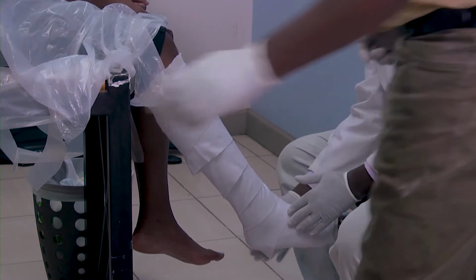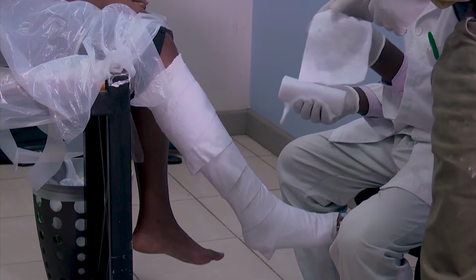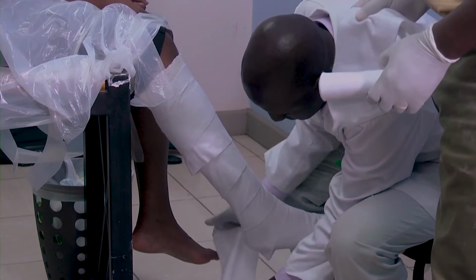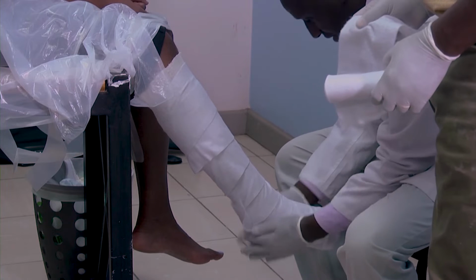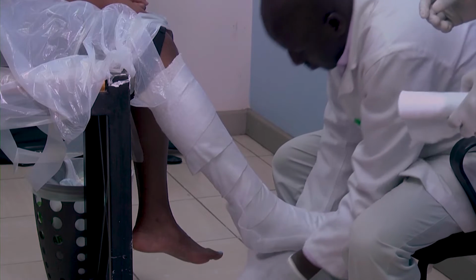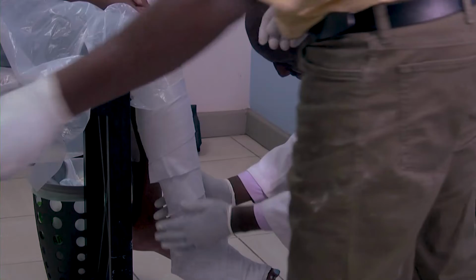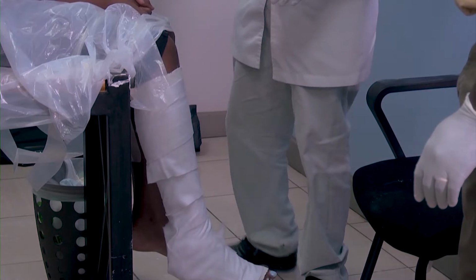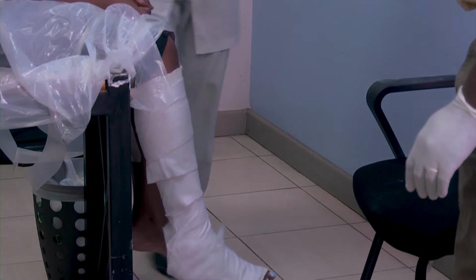Then, for those prominent areas, we want to make sure that we secure them. So cut a small piece, then another piece. We apply one at the heel, coming all the way up, and the other at the malleoli, the medial and then the lateral. It's very important to secure those prominent areas of the bone. Having applied your soft band and secured both areas, now we get the posterior slab.